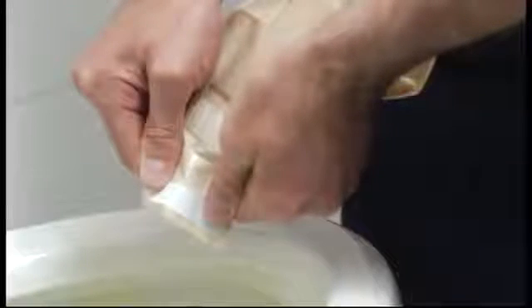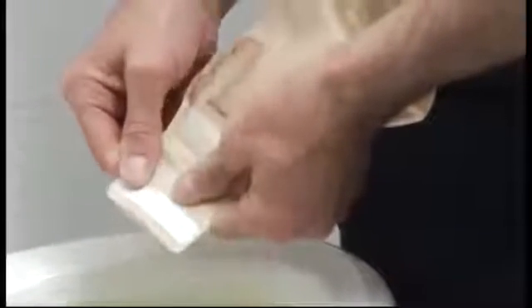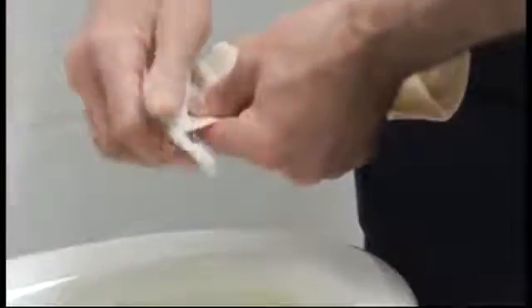The white strip at the bottom of the pouch helps open the pouch tail. Squeeze both sides of the strips as shown and drain the pouch. Use tissues to clean the tail. Make sure to wash your hands.